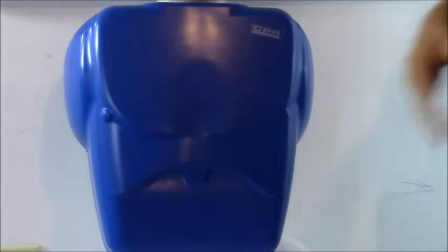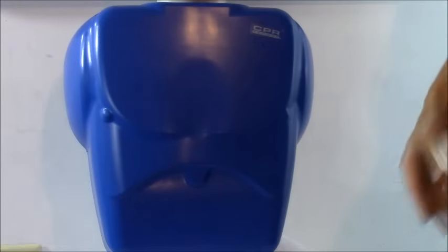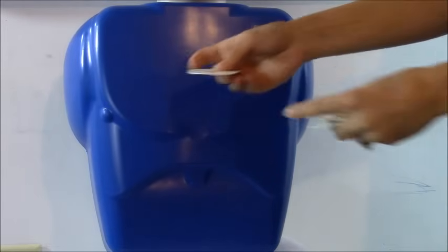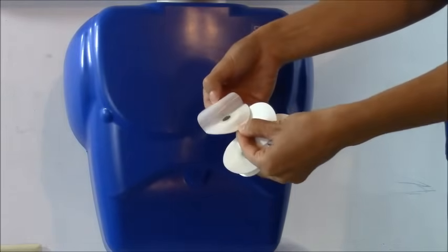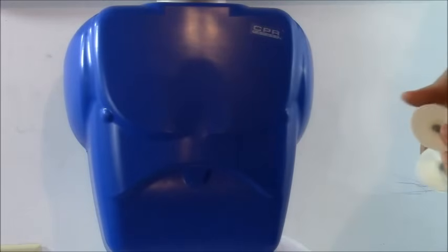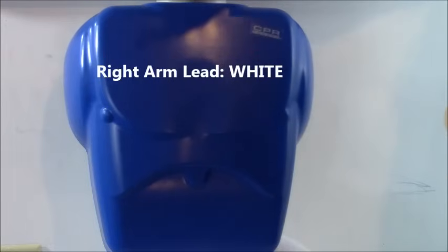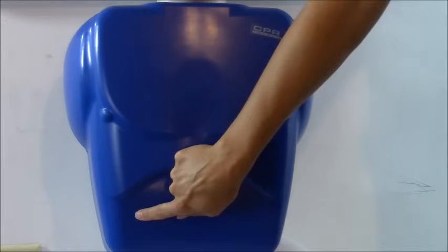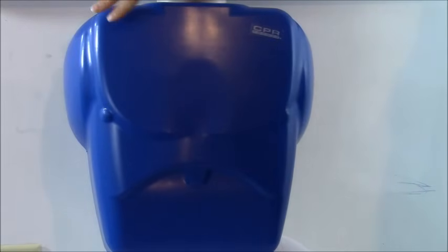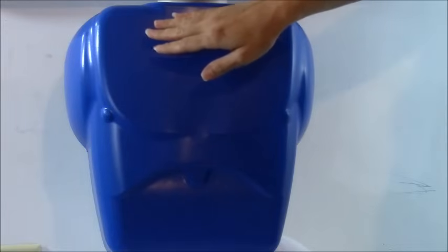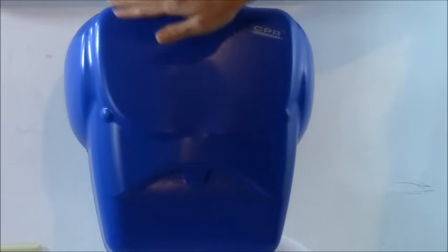You'll want to expose the chest and you'll get your telemetry box, put the battery in the box and get your sites ready to put your little electrode stickers. On the back of each electrode is a little backing that you'll have to peel off like that. And first I like to start over here on the right side. What you have first on your right side is your right arm lead and your right lower leg lead. And this will be white and green. How I like to remember that is snow, which is white, over grass.